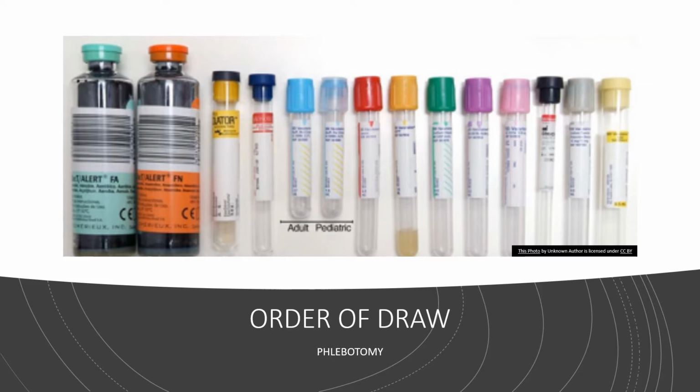So also later on, I'm going to talk about the flower picture that you're going to find multiple times in the paperwork that you have online, in your lab manual, in multiple places, that you can use as a tool to help you start to memorize the order of draw. And if you'll look at the picture here on the screen, this is a really good representation of that order of draw, because those first two larger tubes over to your far left-hand side are blood culture tubes, okay?